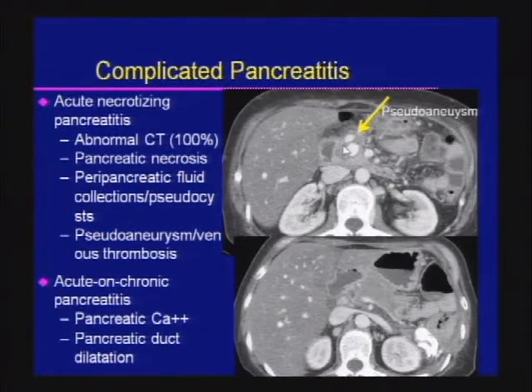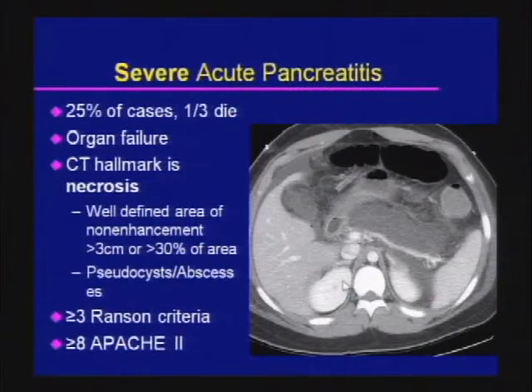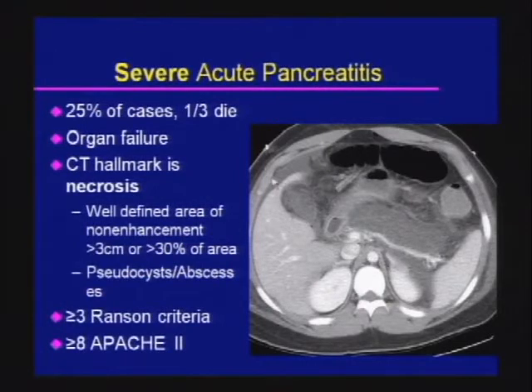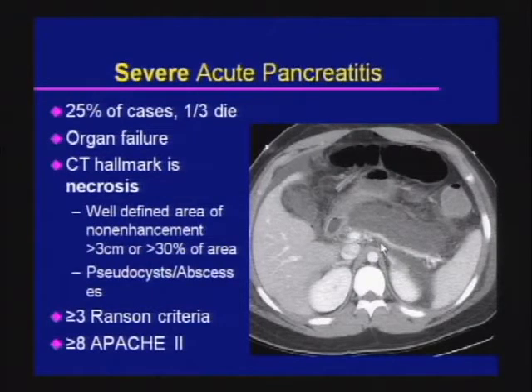Here is a complication of pancreatitis: a dilated vascular structure representing an aneurysm of the gastroduodenal artery, with areas of pancreatic necrosis visible. For severe acute pancreatitis, these patients have significantly higher mortality. To use the term severe acute pancreatitis, you want to see an area of non-enhancement greater than three centimeters or involving greater than 30% of the area of the pancreas.